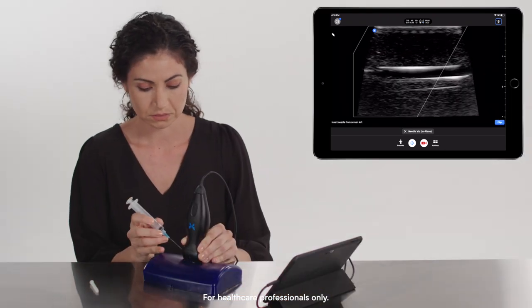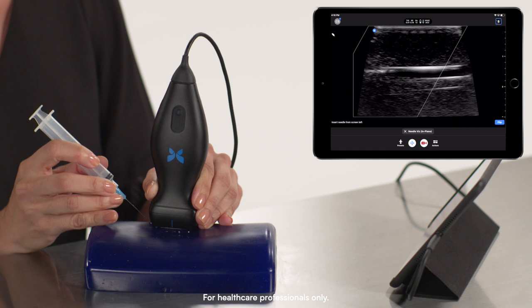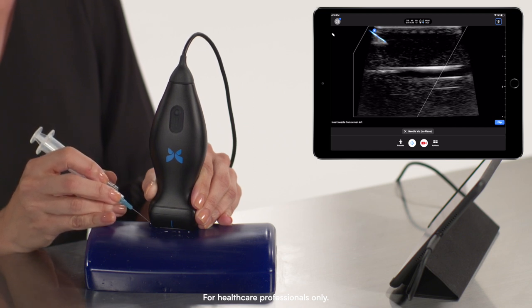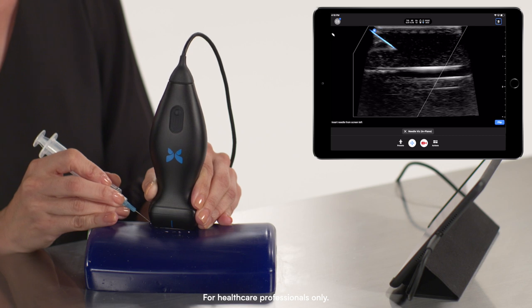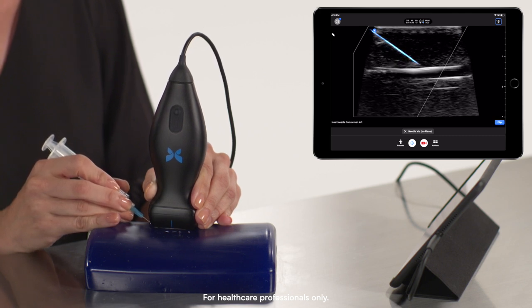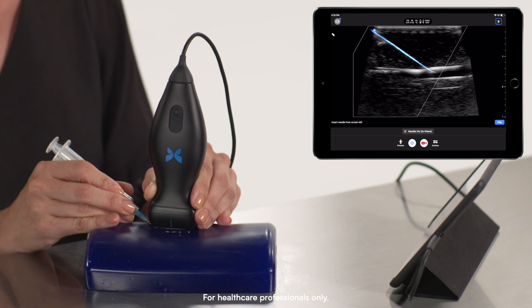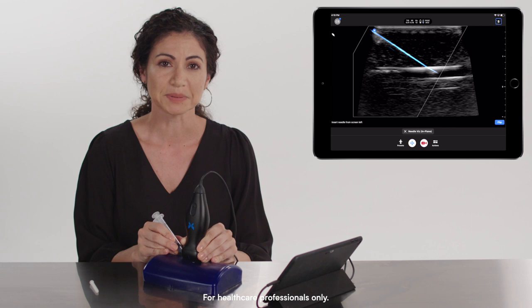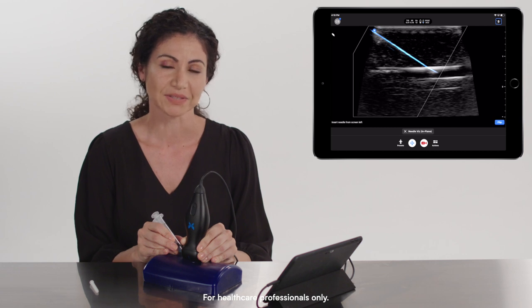Now I will take my needle and approach in-plane to see the tip of the needle and the shaft as it approaches the vessel. And that's an example of the in-plane NeedleViz feature on the Butterfly IQ+.